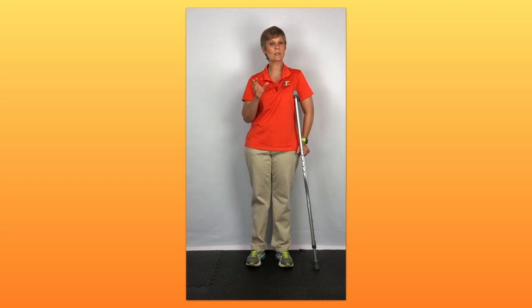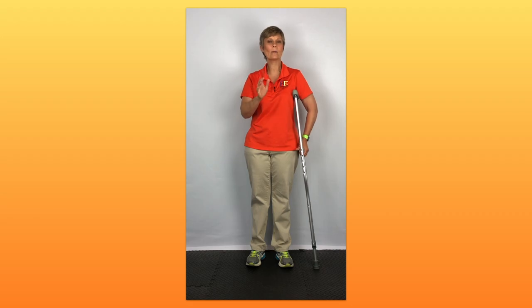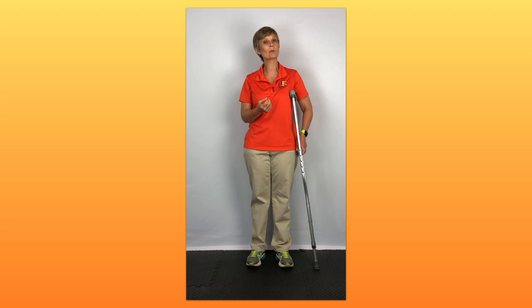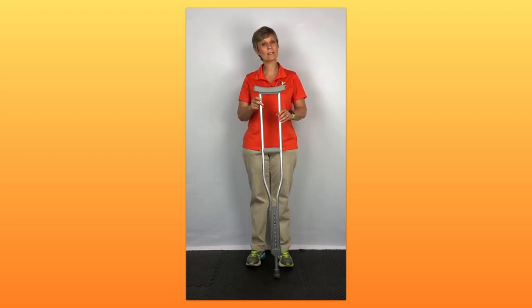One of the common mistakes people make is the crutch is not adjusted correctly. You should have a couple of finger widths of room between your armpit and this crutch. People also tend to lean on the top of this crutch, which can cause a lot of problems. There are nerves that run underneath your armpit, and it can cause problems for your arm — sometimes called crutch palsy. So again, this is a standard axillary crutch.